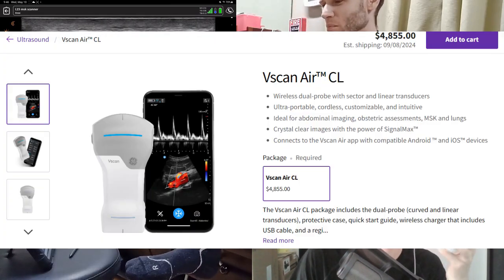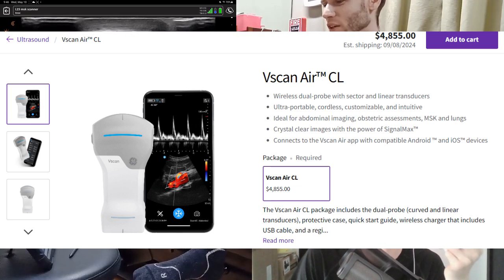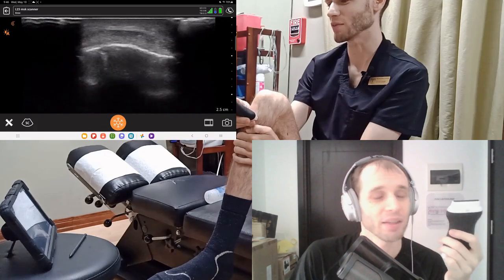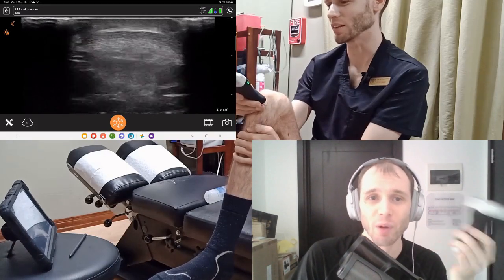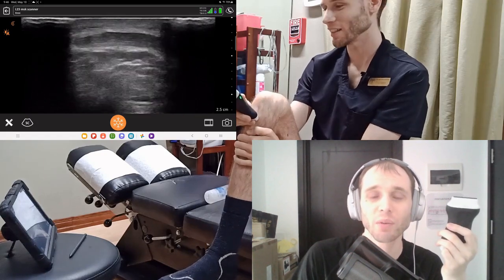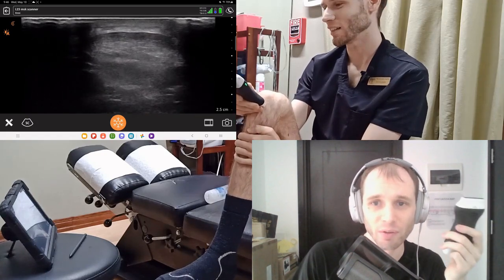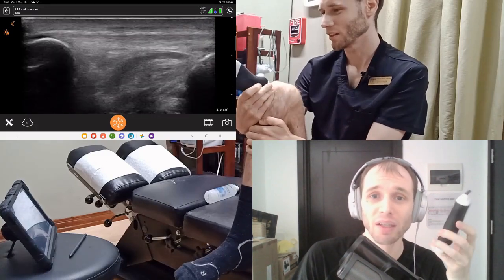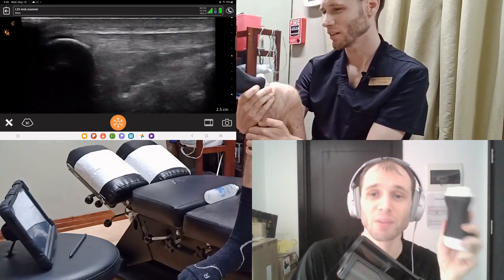The other comparable handhelds to the Clarius lineup, like the GE vScan Air and the Philips Lumify, have linear transducers similar to the L7 in terms of footprint and frequency. For the majority of MSK purposes, you won't be disappointed with the images the L15 gives you. I don't think there's a handheld from another company that gives better images for depths less than 4 cm.